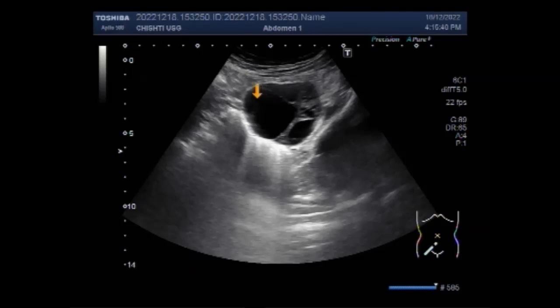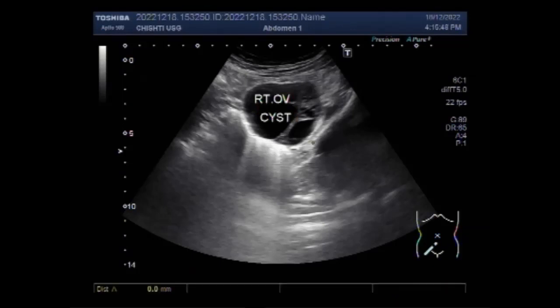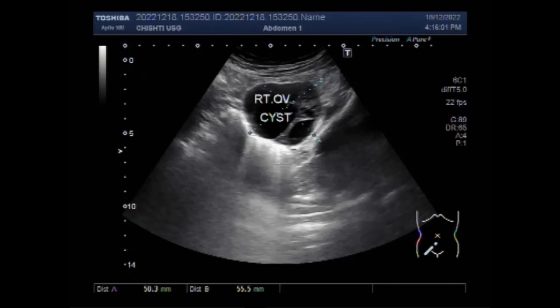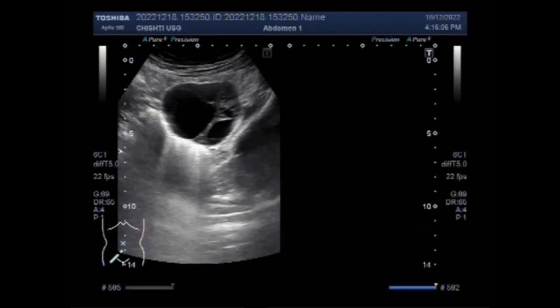Molar pregnancy is when there is a problem with the fertilized egg, which means a baby and a placenta do not develop the way they should after conception. A molar pregnancy will not be able to survive. You can see the multiseptate right ovarian cysts — multiple septa are also seen.